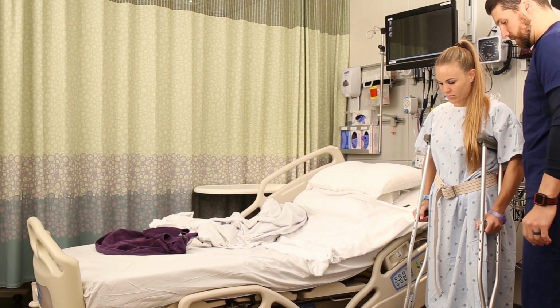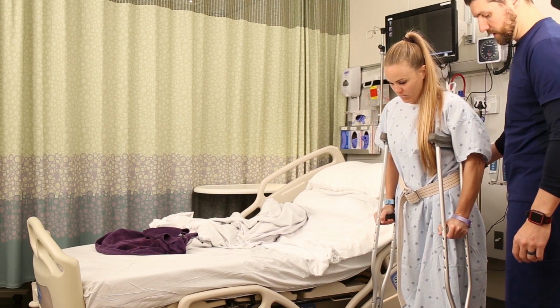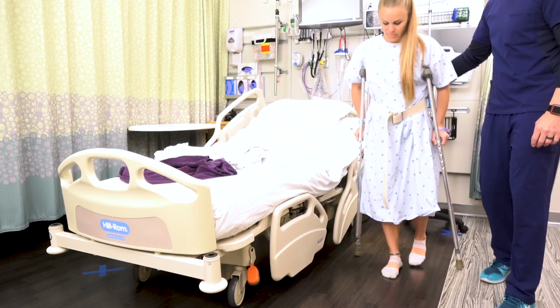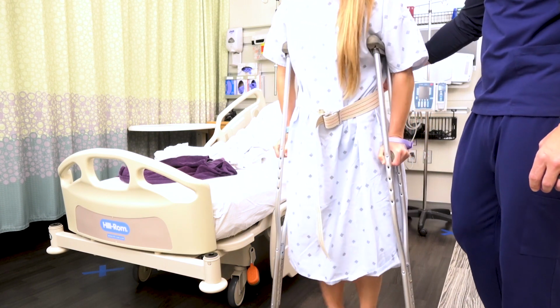Now, for crutches, for partial weight bearing, we use a 3-point gait. They should advance the crutches and the bad leg at the same time, then the good leg. Crutches and bad, and then the good leg.